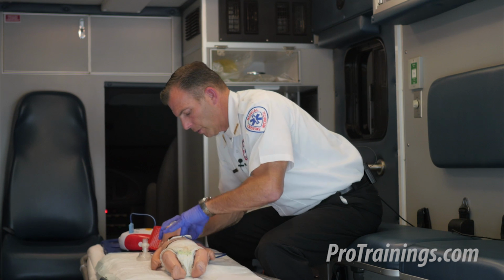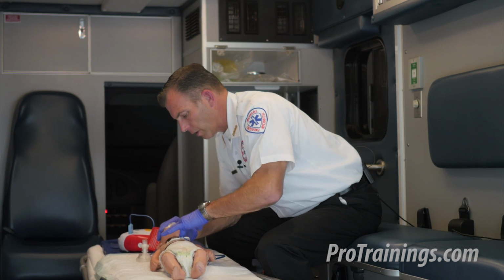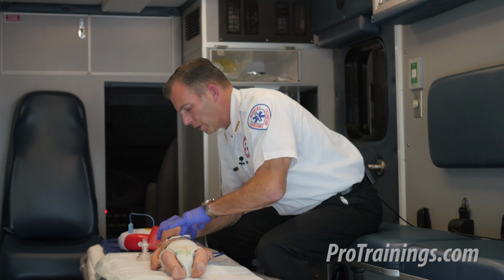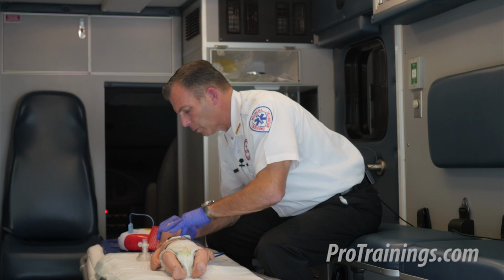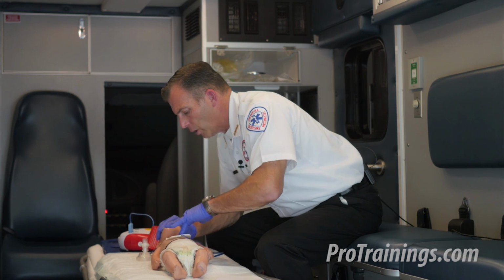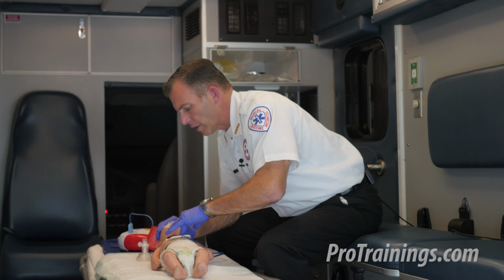One, two, three, four, six, seven, eight, nine, ten, eleven, twelve. Now I'm going to continue to do these 30 compressions and 2 rescue breaths until the baby begins to respond, breathe normally, or more definitive care takes over and the patient is then taken to the next level of care.